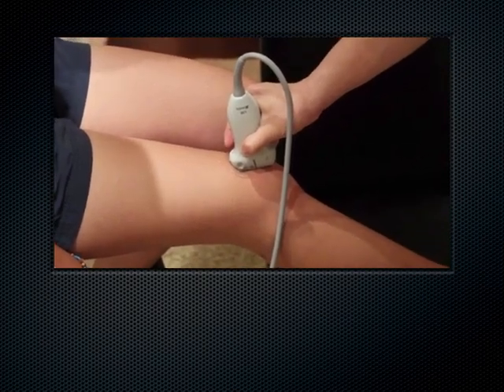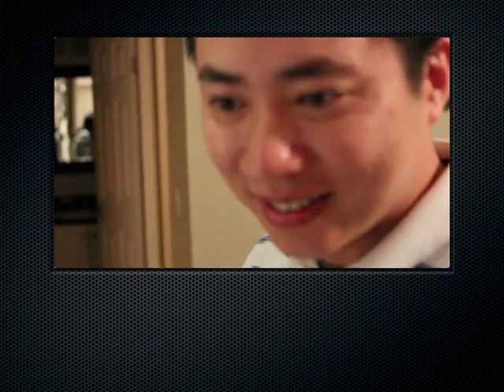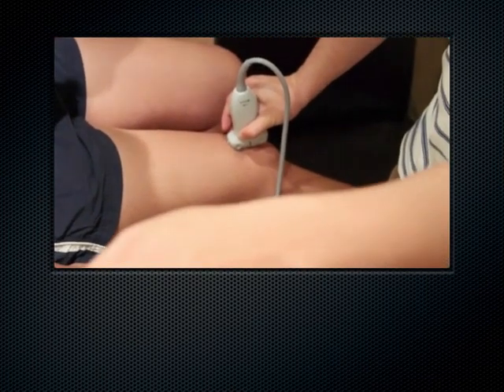So this is a long axis view of the patellar tendon inserting. Actually, take it back. This is the quadriceps, but it's the same tendon. So, the same tendon. And then this is a long axis view of the patellar tendon. You could see that it inserts.